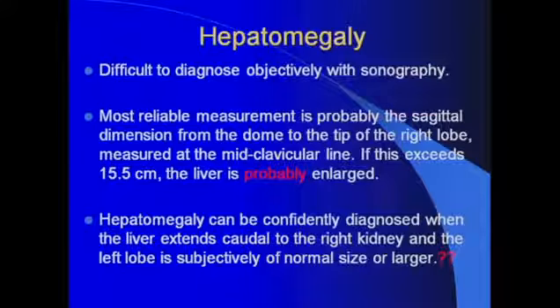The problem that we encounter in imaging as radiologists is that whenever we deal with a 2D image, quantification of the size of organs is somehow difficult and inaccurate. We have known that fact for many, many years. The only way to establish correct measurements of organs in the abdomen, like the liver, spleen, and kidney, is to invest more time in volume measurements, which in practice may not be practical for radiologists and can be time consuming.